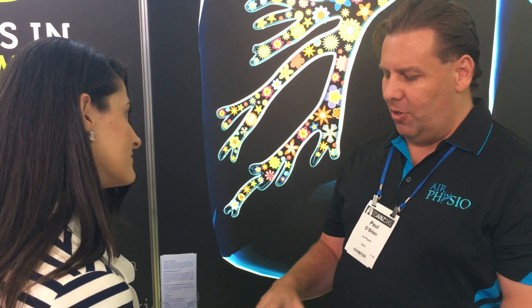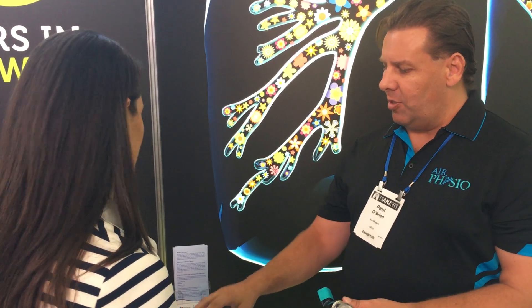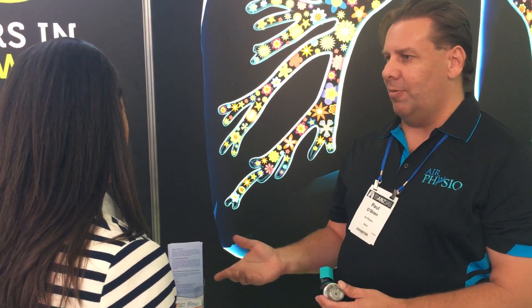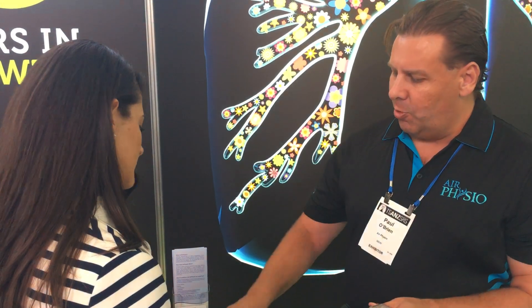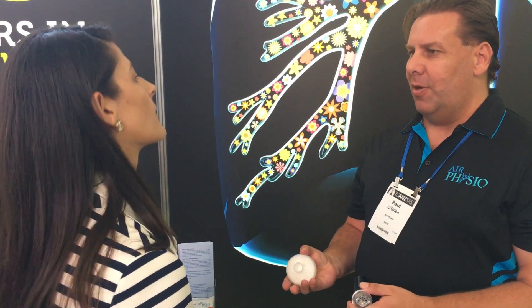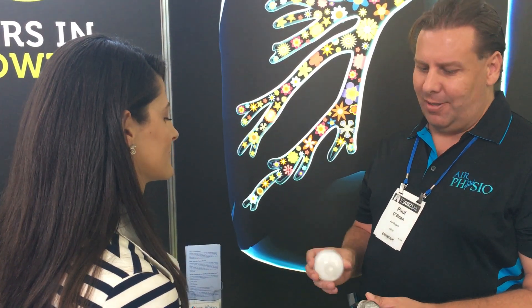We've created different versions of the device: a children's low lung capacity version, an average lung capacity version — which is called the mucus lighter — and a sporting version for people who are more active but still require mucus clearance and actual lung expansion.